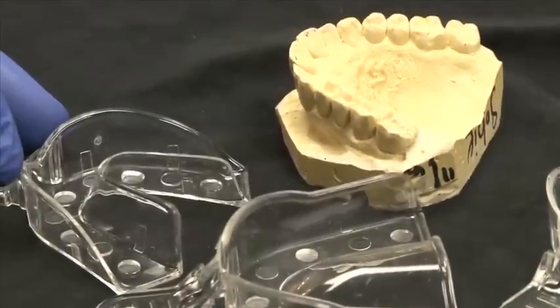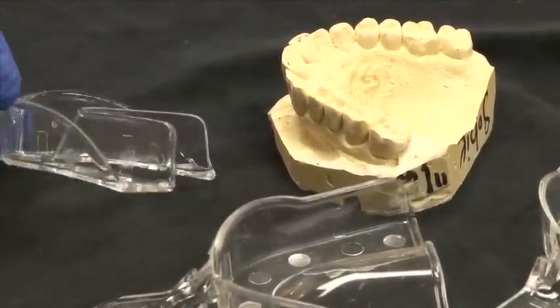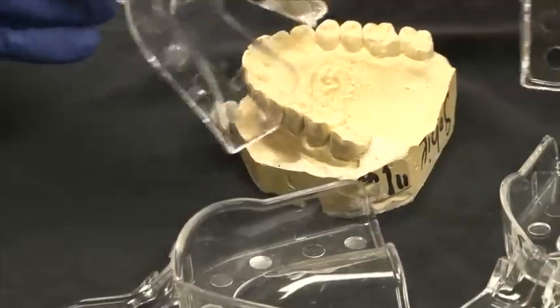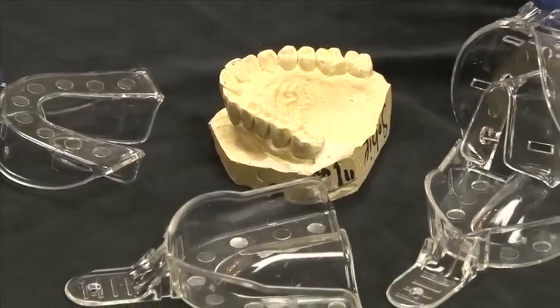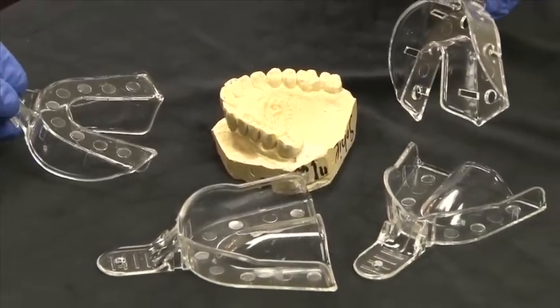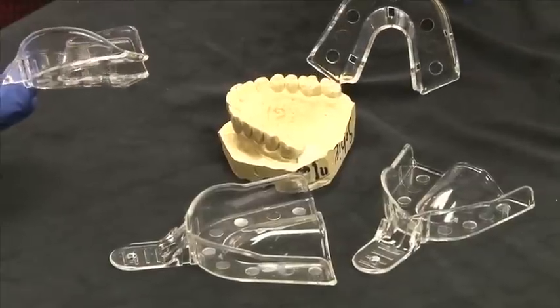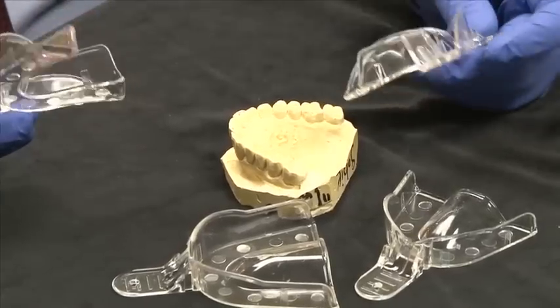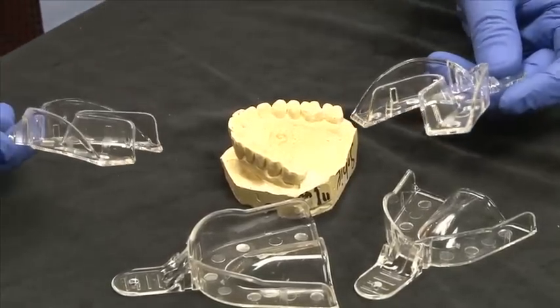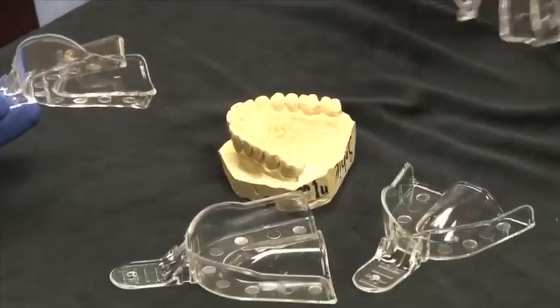I'd like to introduce you to the clear plastic tray from Affordable Dental Products. The clear plastic tray either comes with holes or solid without holes, and they come in three sizes for the upper and the lower. They also come with organizer boxes to help keep them organized, which makes life very easy for your assistant in finding the tray size you want for a given case.